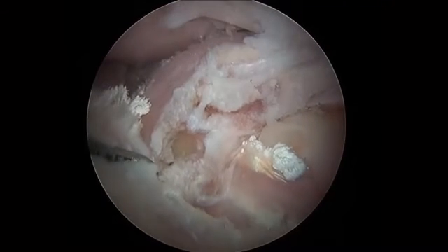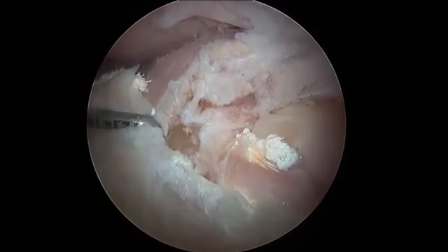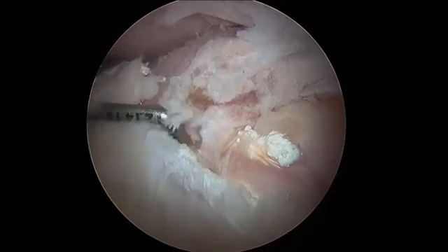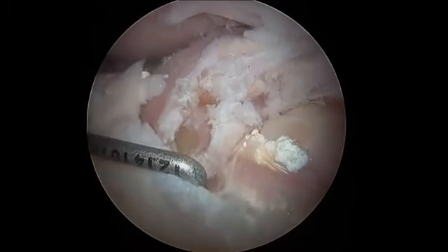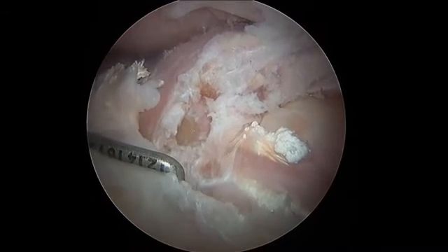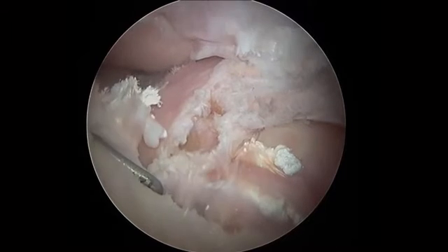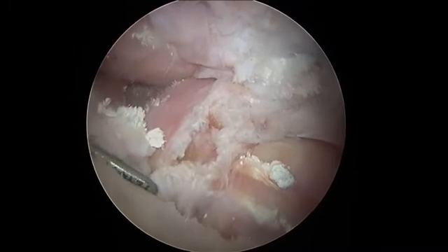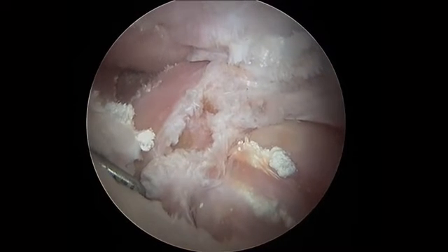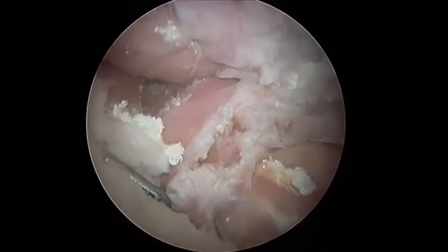In relatively a central region of the tibial footprint. Again, if anything, it's a little bit on the medial aspect of the tibial footprint, and I certainly try and not be too anterior. You can straighten the knee just a little bit. And when we straighten the knee, we see that there are a lot of fibers anteriorly. I don't want to come through those anterior fibers with my tunnel. So there's a good view of my position for a tibial tunnel.